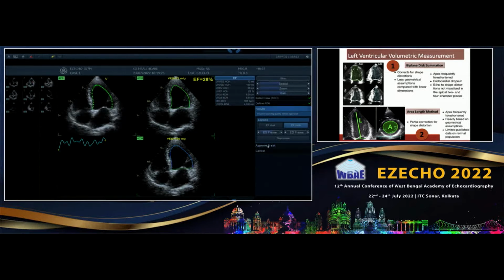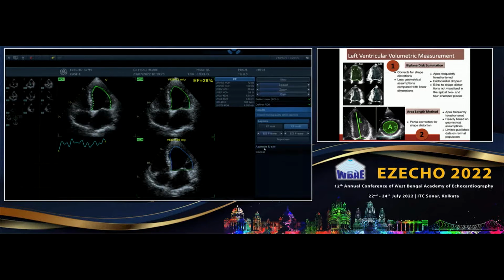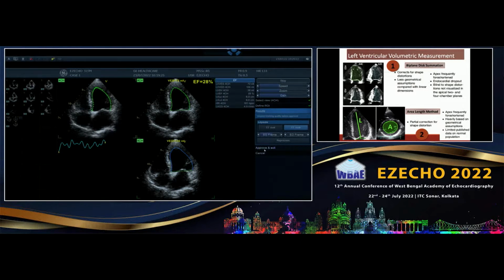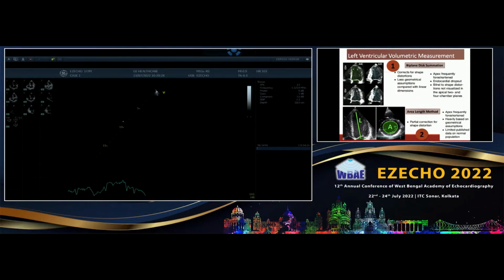You can tell simultaneously. Can you give a very brief two-sentence history of the patient so that we can check? Nitin, you can open the mask, otherwise. Okay, sorry. Can you just tell us something about the patient? Okay, fine, doesn't matter. Now, I think the ECG lead is slightly going up and down. Can you check the ECG lead? ECG is not coming properly. I think get an image first.